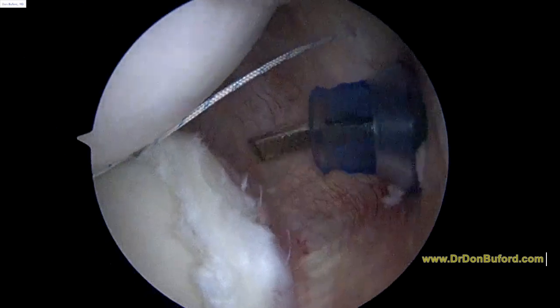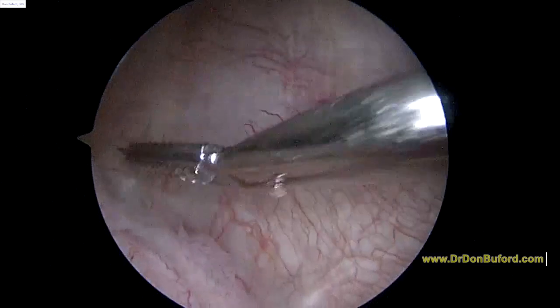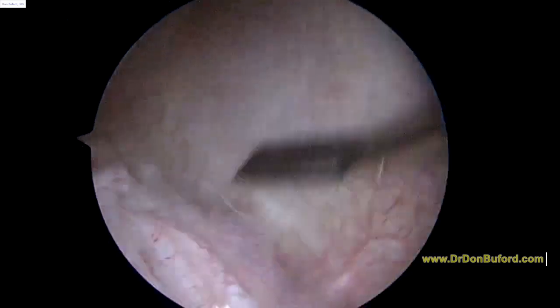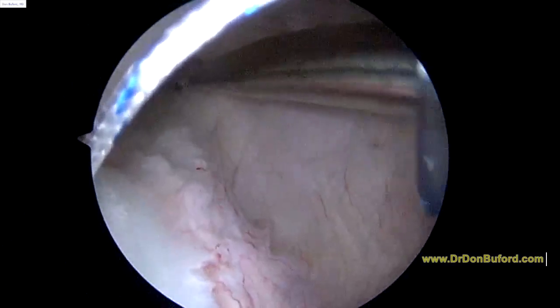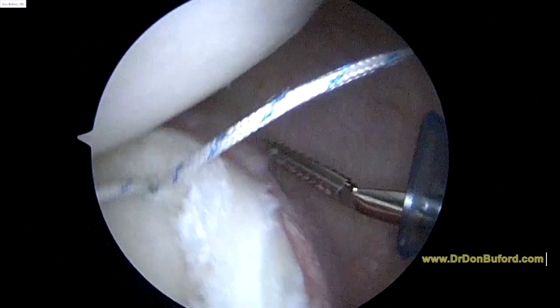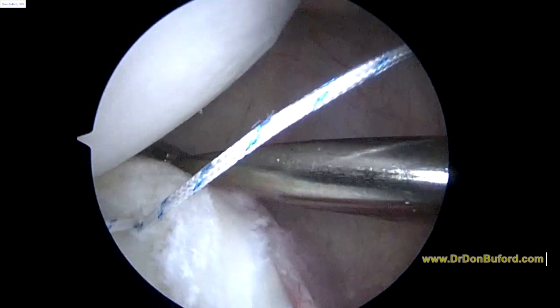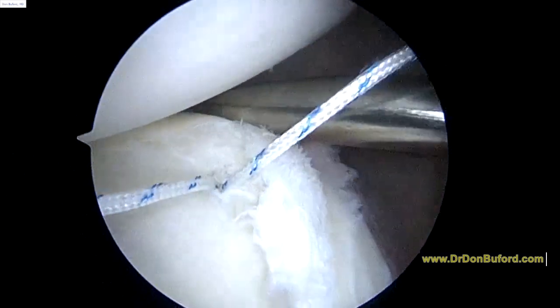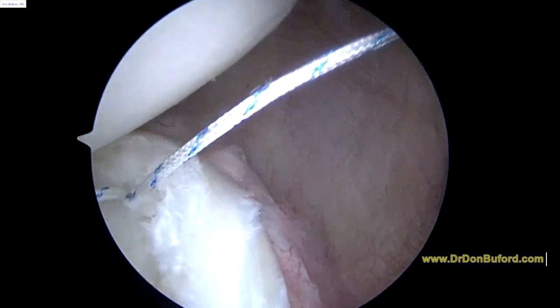So here's our rasp coming in. We use this just to gently roughen up the capsule. As you see here, it's got these sharp points on it. And this way we can create a healing response without removing any tissue. And we'll just work all through this area where we're going to be operating to try and create this healing response. And basically we're trying to make this like a piece of Velcro, so it sticks together and starts to heal. In a minute, we're going to take a suture hook loaded with a black wire called the shuttle relay. You'll see that come in here next.